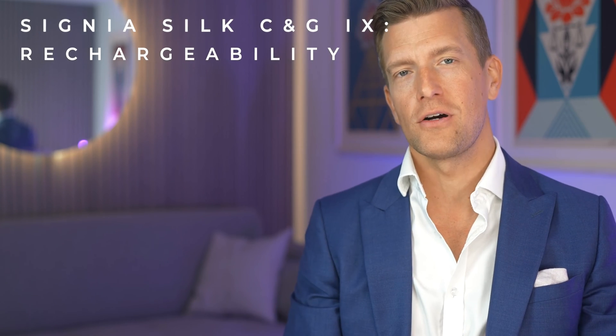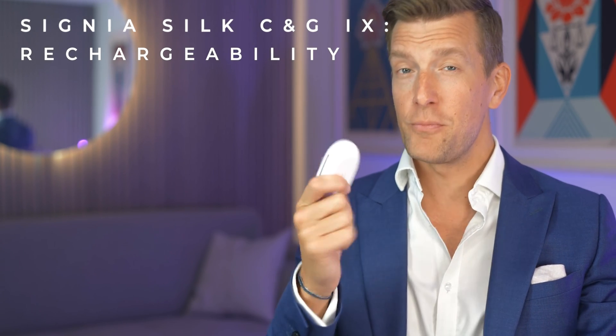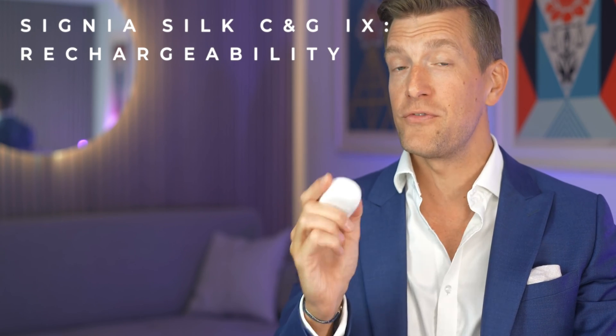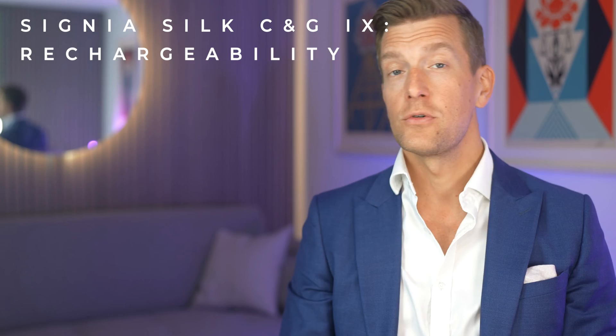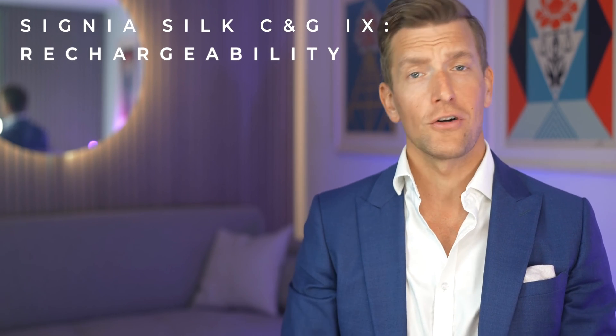Back to rechargeability: a single three-hour charge will give you 24 hours of life, so each charge will last you for a full day. The case itself is neat and pocket-sized, and rather impressively given its size, has a built-in battery which provides an additional three days' worth of charge before it needs charging again. So if you go away for a long weekend — for example, a camping trip — all you need is the case and you can charge on the go.